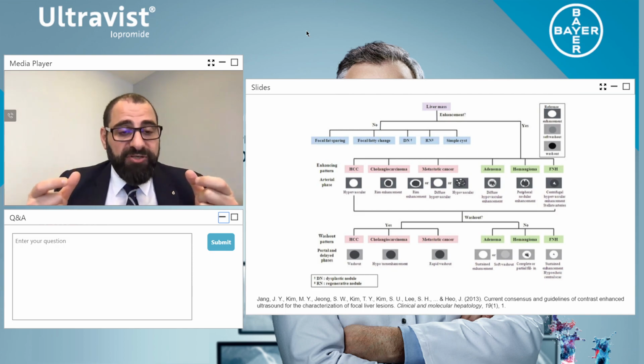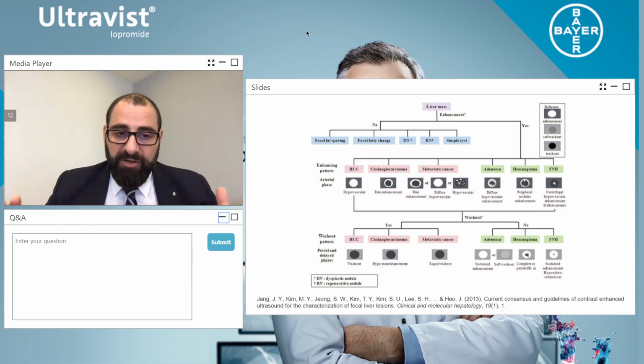Use 2 syringes. Please, ladies and gentlemen, do not multi-use your syringes, because if a patient has hepatitis, you could infect another patient with hepatitis if you're multi-dosing. So always use separate syringes and turn them over. I know there could be a financial issue behind it, but I will say this: if this was your mother or your father, brother or sister, would you expect me to give your parents a clean syringe, or do you want me to reuse one because of someone else? I really believe in this.